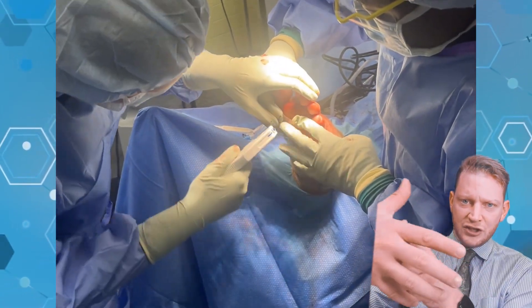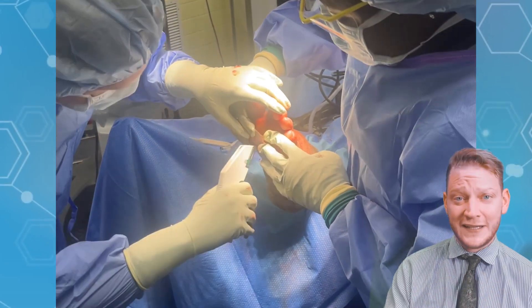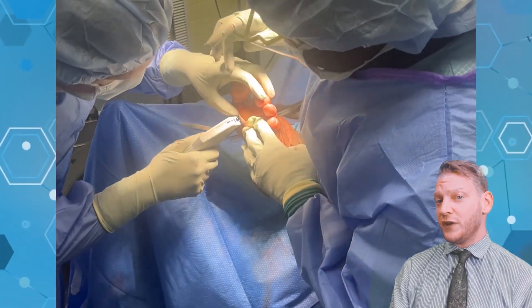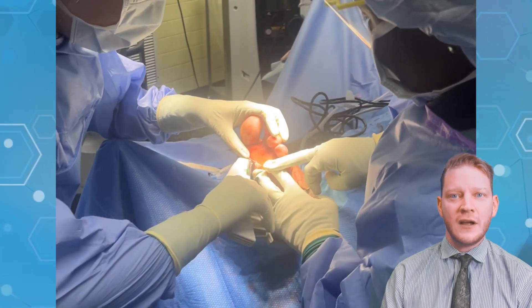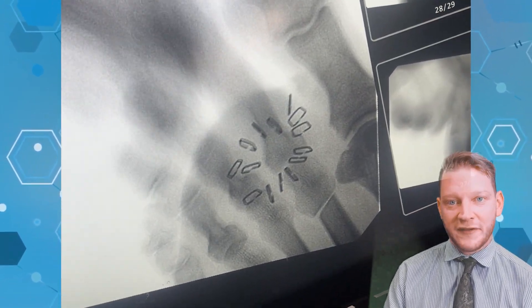Sometimes the graft gets scrunched up as you start doing it, so you staple north, south, east, west just so it stays in its shape. The Kerasis graft is really good compared to some of these other skin substitute grafts in that it's very tough and extremely durable, so it doesn't get torn up from being on the bottom of somebody's foot.